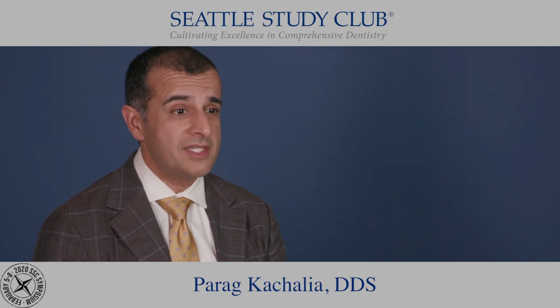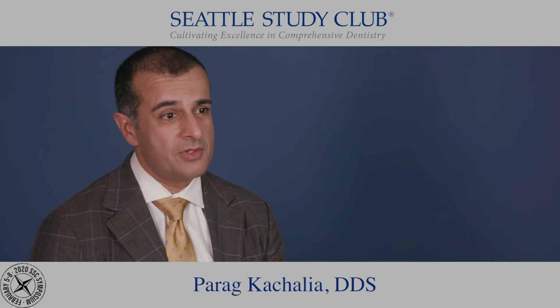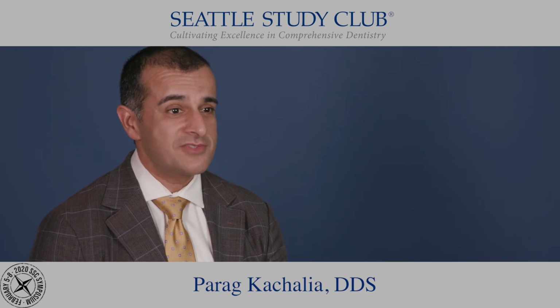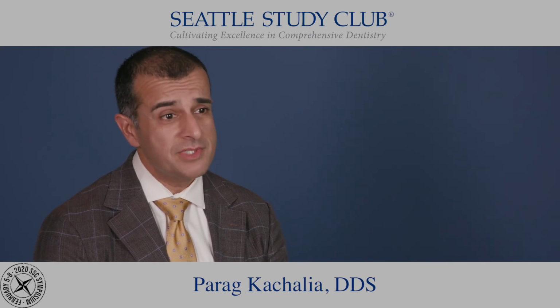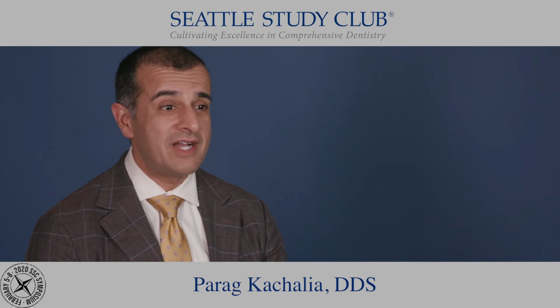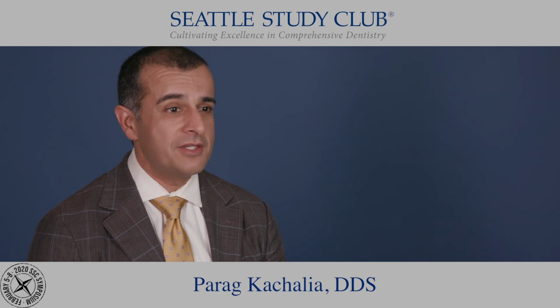So when I refer my patients back to the endodontist, or the oral surgeon, or the periodontist, there's a comprehensive care approach to see what's happening, and we share that data set back and forth. We always used to think cone beam imaging is just for the specialist. I don't think that's true anymore. Cone beam imaging is what panoramic imaging may have been 25 or 30 years ago. It's a data set for our patients so we can diagnose properly.